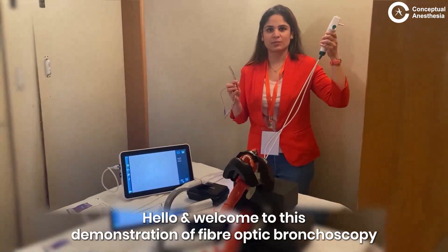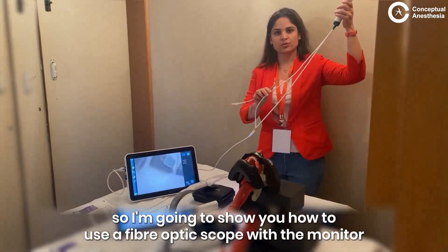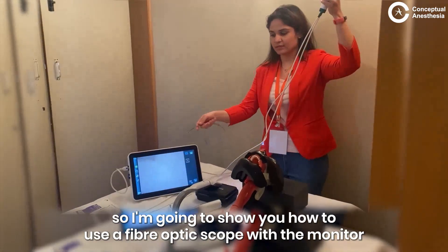Hello and welcome to this demonstration of fiber optic bronchoscopy. My name is Dr. Chanvi. I am going to show you how to use a fiber optic scope with the monitor.